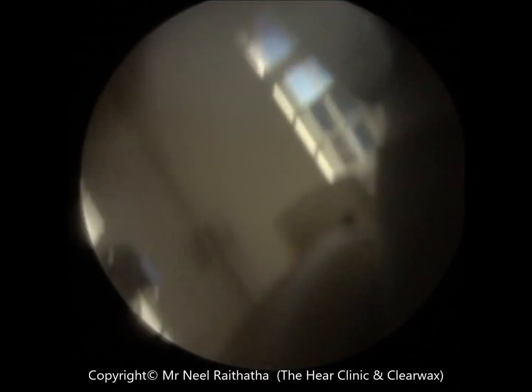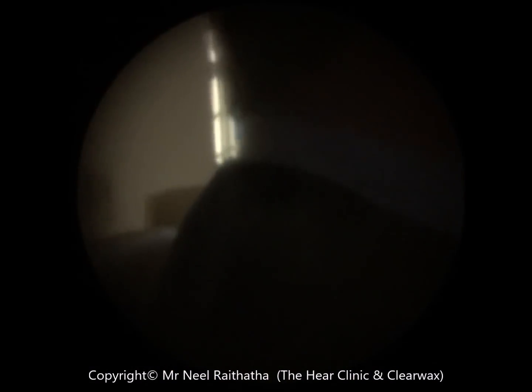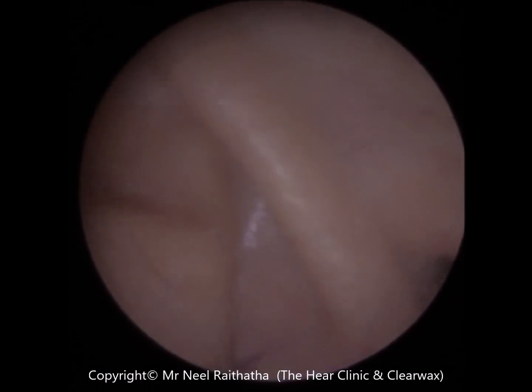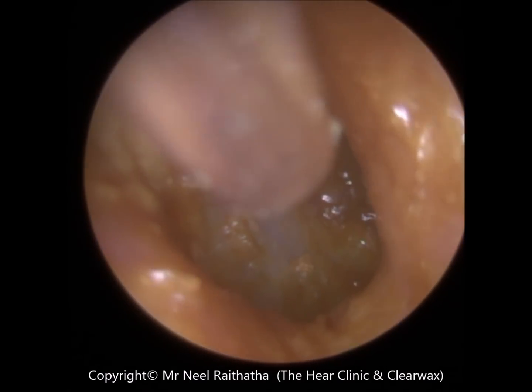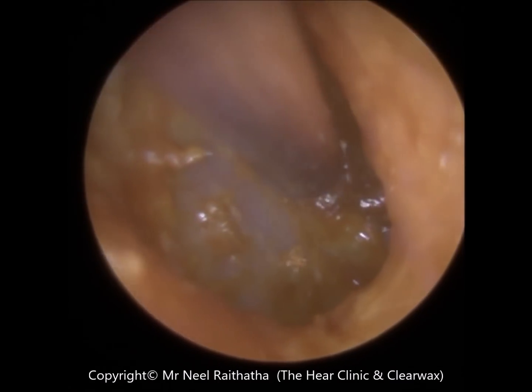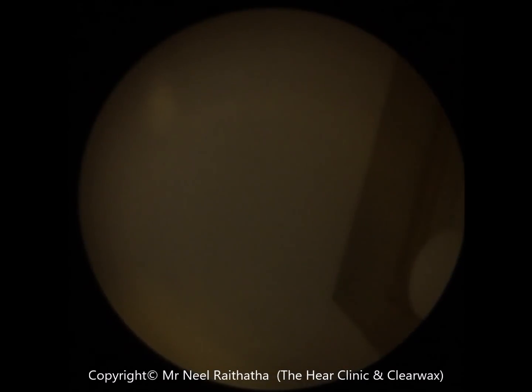I'm going to go in with a different instrument because we're approaching the eardrum. This is a fine end — it's less suction power, so it makes it a bit more work on my part, however it's more comfortable in your ear, especially when we approach the eardrum. I've just got some wax plastered over the drum so I'm going to try and remove that. I'm going to curl the tube so we can get access to it, otherwise we'd make contact with the bony part of the ear canal which is very sensitive.